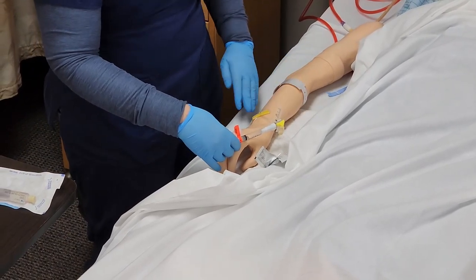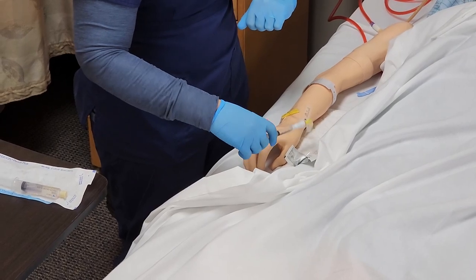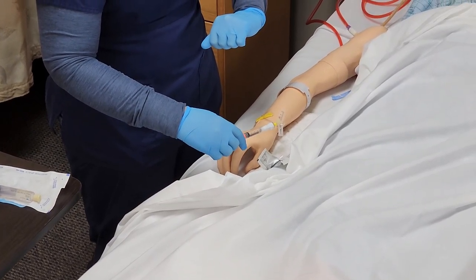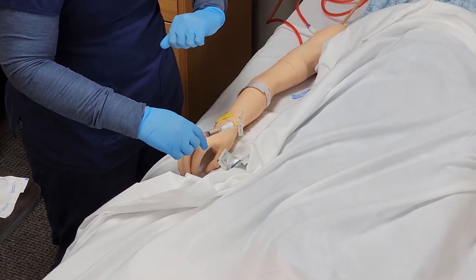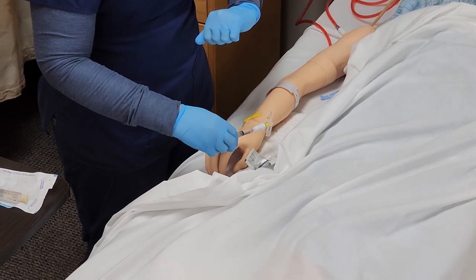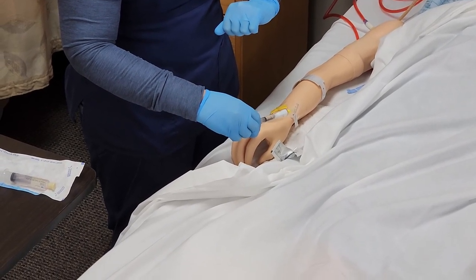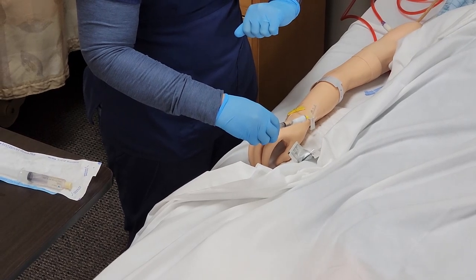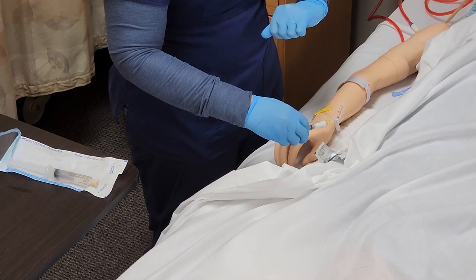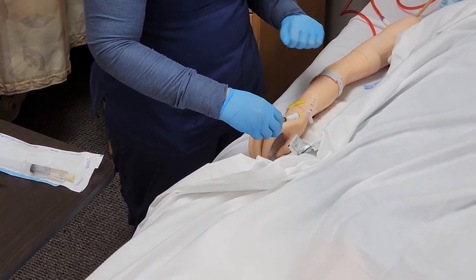Now I'm going to go ahead and administer my medication at the prescribed rate. At the same time, I'm asking my patient how their IV is feeling and how they are feeling. I did any prior assessments that I needed to do, and the medication is going in at the prescribed rate.